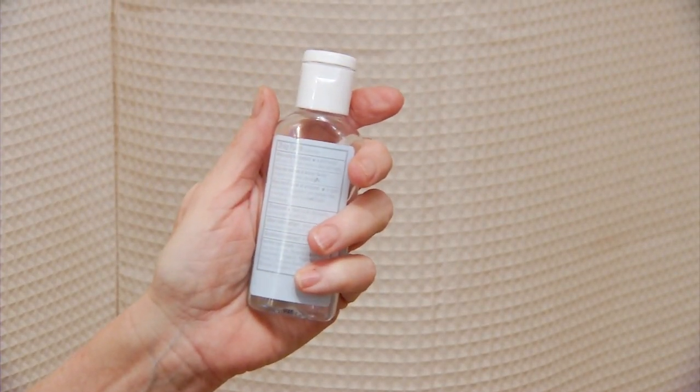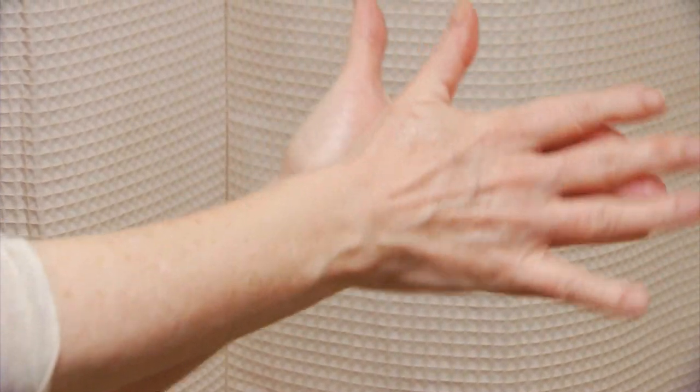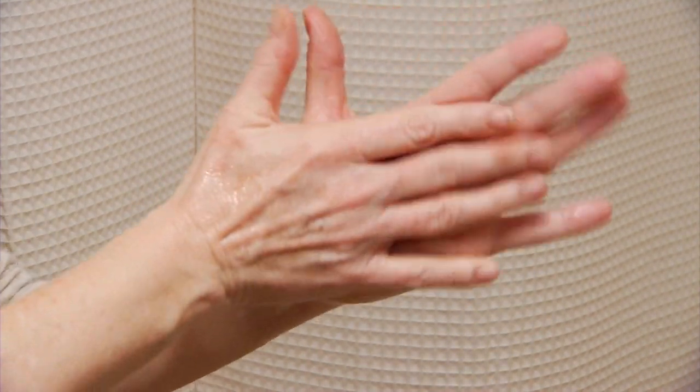If you're using an alcohol-based hand sanitizer, be sure to cover all of your hands with it, rubbing them together until they're dry. Cleaning your hands properly, also called hand hygiene, is an important part of caring for your drainage catheter.